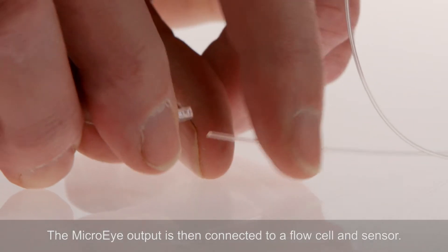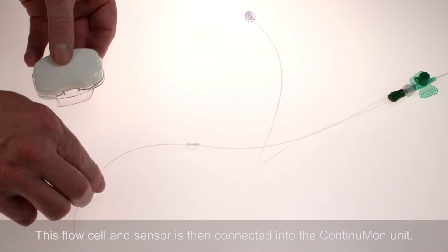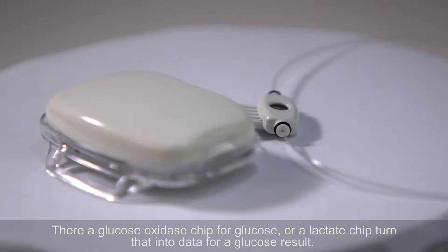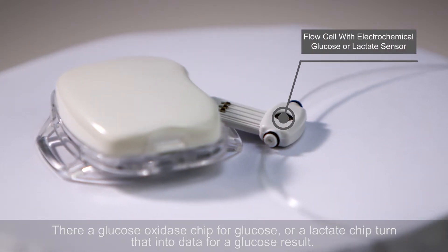The MicroEye output is then connected to a flow cell and sensor, which is then connected into the ContinuMon unit. There, a glucose oxidase chip for glucose, or a lactate chip, turns that into data for a glucose result.